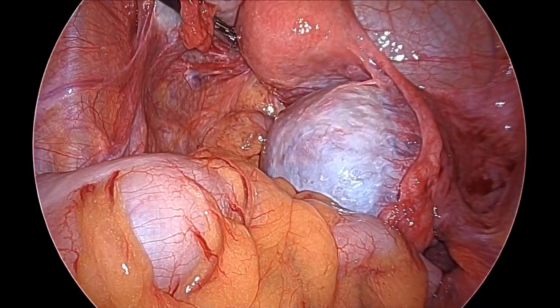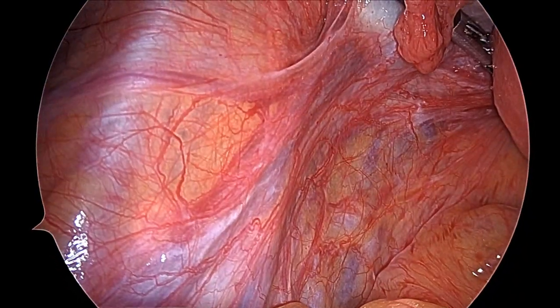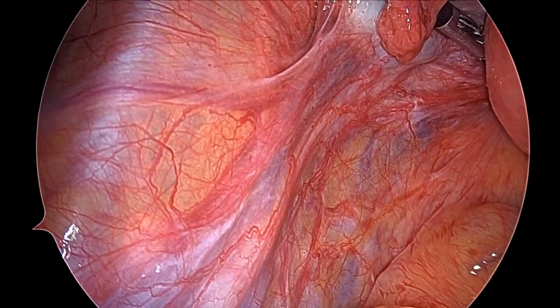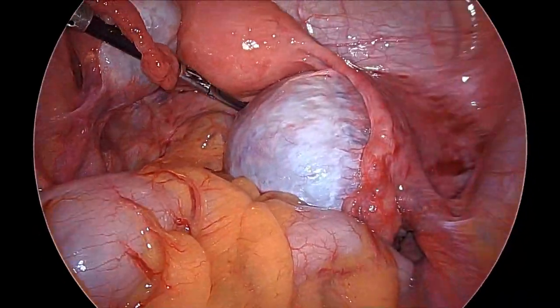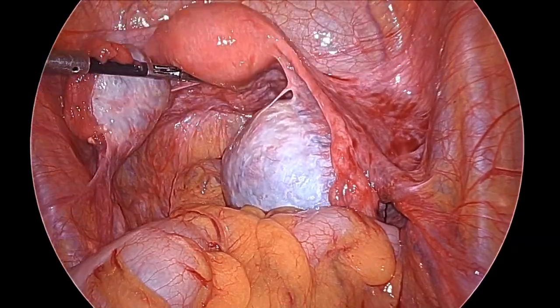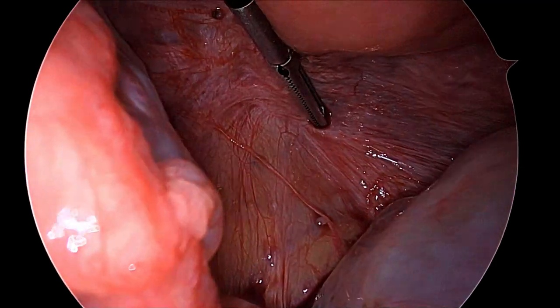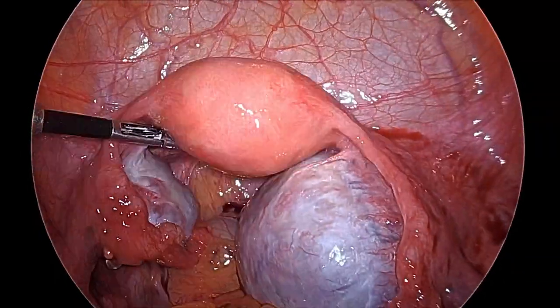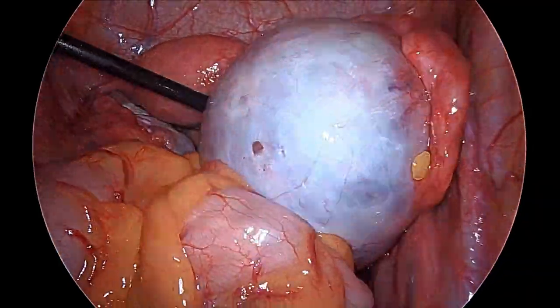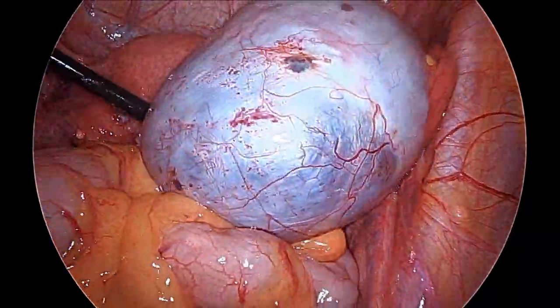The left side is fine, and the left ureter with visible peristalsis is identified. This gray area is the cul-de-sac, and on either side this gray area and the uterosacral ligament are also visible. After the initial diagnostic laparoscopy we will now begin the procedure.